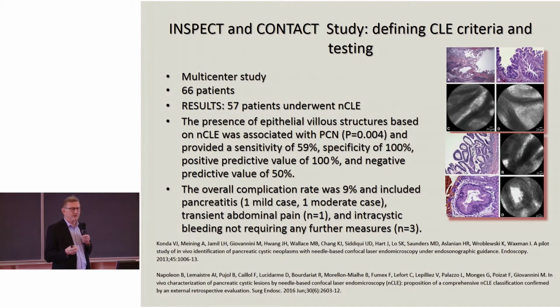In particular, for serous cystadenomas, whenever you see these characteristic findings, you can almost certainly be sure that this is serous cystadenoma.